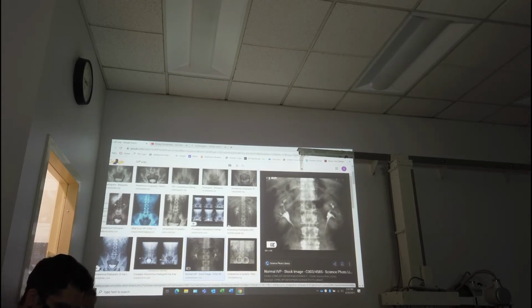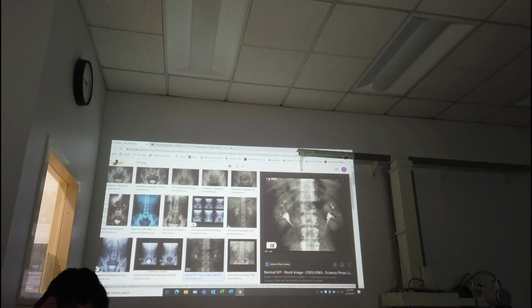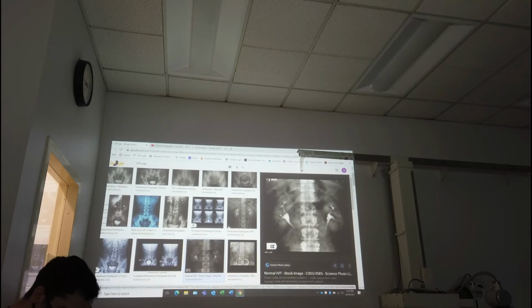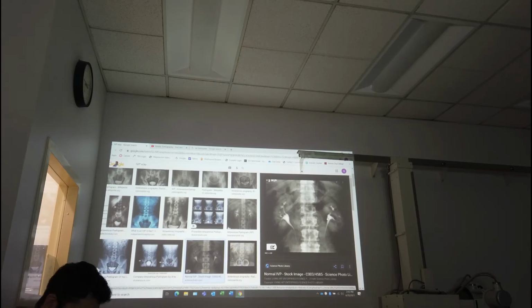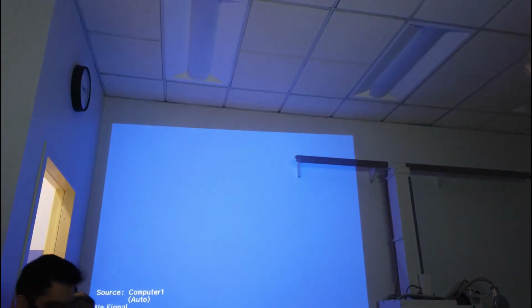And then you can drip it too. A lot of times you'll get these bottles where you can hang them upside down from the IV pole. Or sometimes the contrast will come in little baggies, almost like the lactated ringer bags, little itty bitty bags. Sometimes you see medication that they're dripping into somebody's IV in a little bag. So they're very similar to that, where it just drips, and those are called drip infusion. So bolus or drip infusion, as usual, is how we get contrast into patients. Bolus is the most common because you're pushing a large amount of contrast really quickly into the patient.